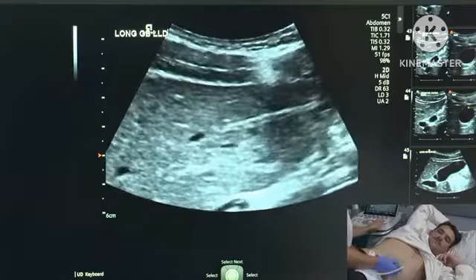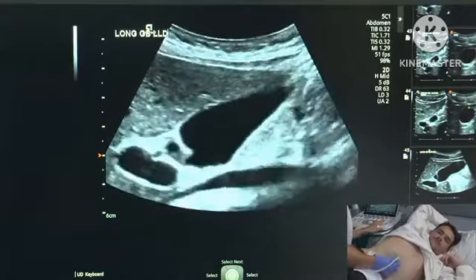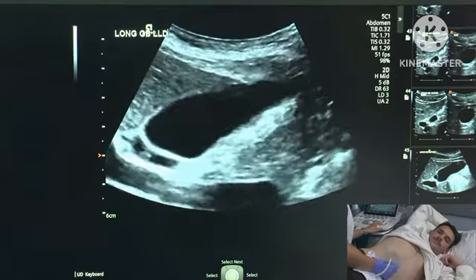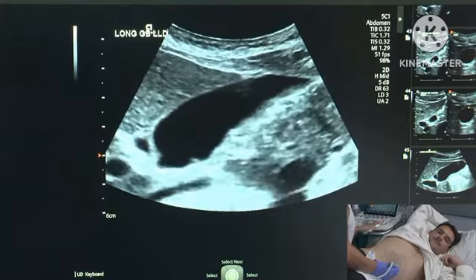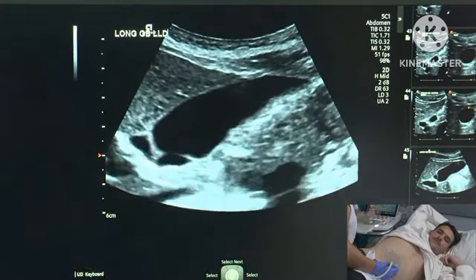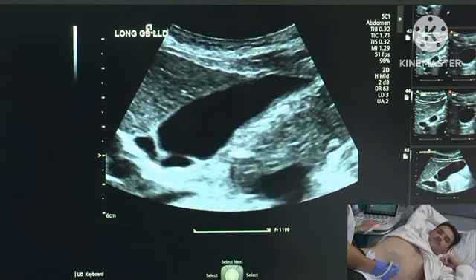There we are. Big breath in for me when you're ready. Good. And again, really showing that that fundus is completely clear and that there is nothing that is moved. My focus is just at the posterior level of my gallbladder. Good, and breathe.